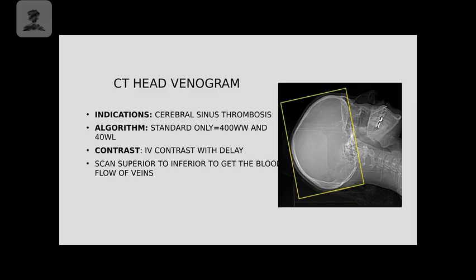Algorithms that we utilize, we only use a standard algorithm. I did accidentally leave in the numbers for this. I always go through all of that with procedures, but you don't need to memorize that because I will not test you on that in this course. But if you take procedures, you're going to understand what window widths and window levels we choose for different exams. We'll talk about window widths and window levels later on, but I'm not going to make you memorize something like this right now.